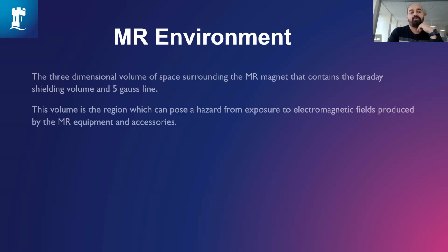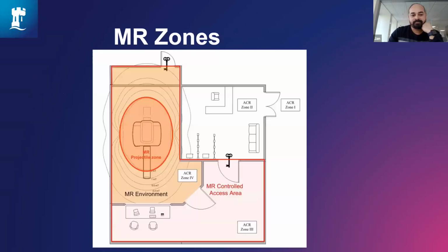Now, what is the volume of this region? Why is this MRI environment so important to look at? It poses a hazard for exposure of not just the magnetic field, but sometimes electromagnetic fields, and the fields produced by the MR accessories too, along with it.